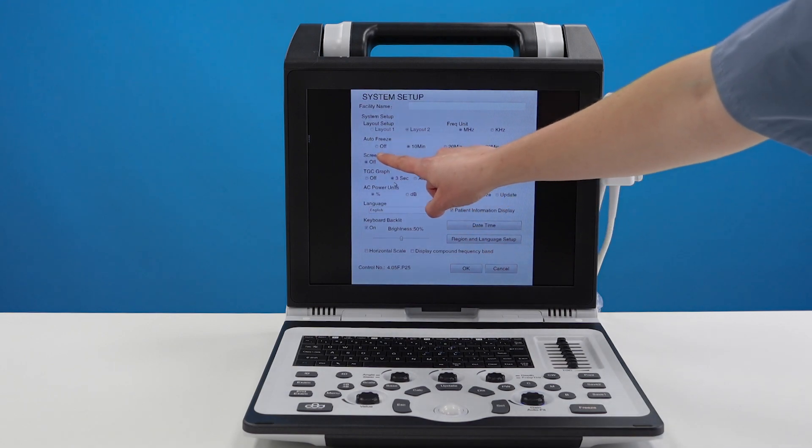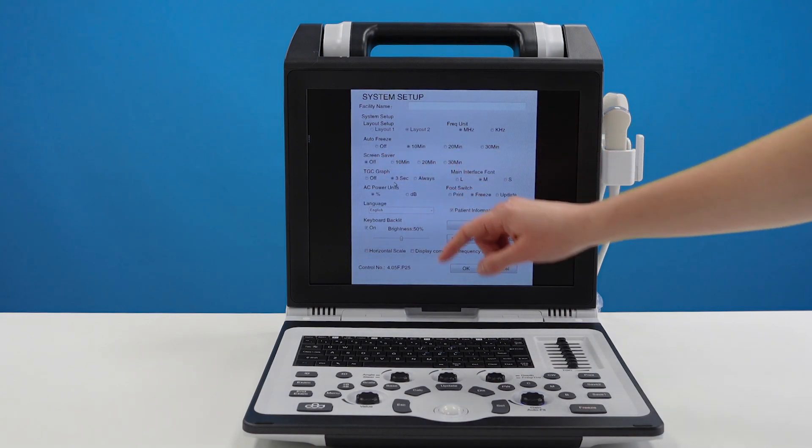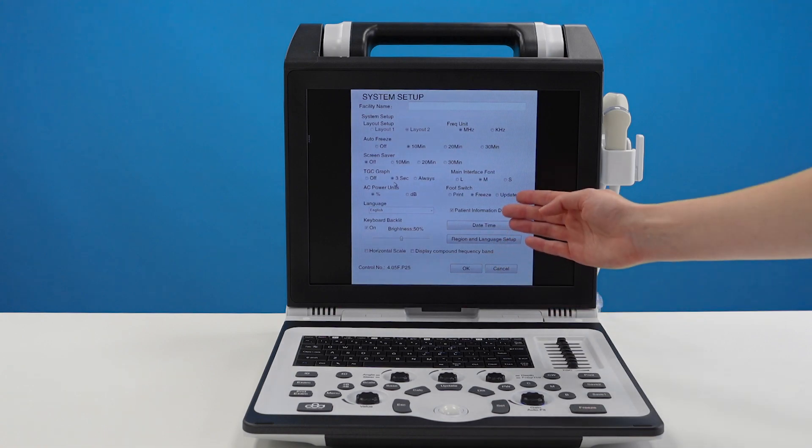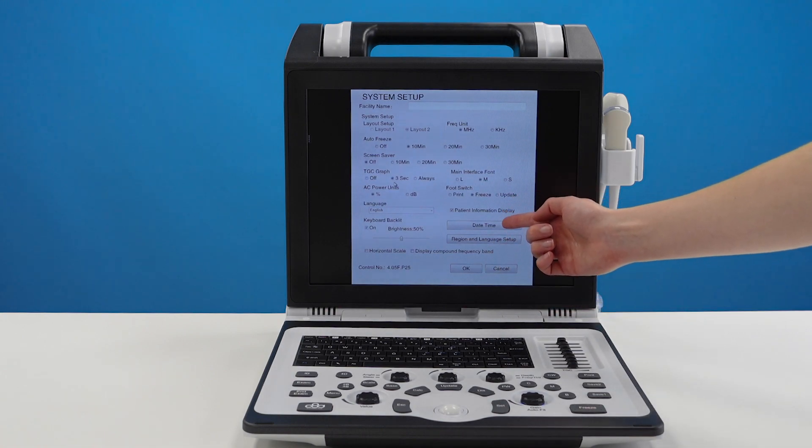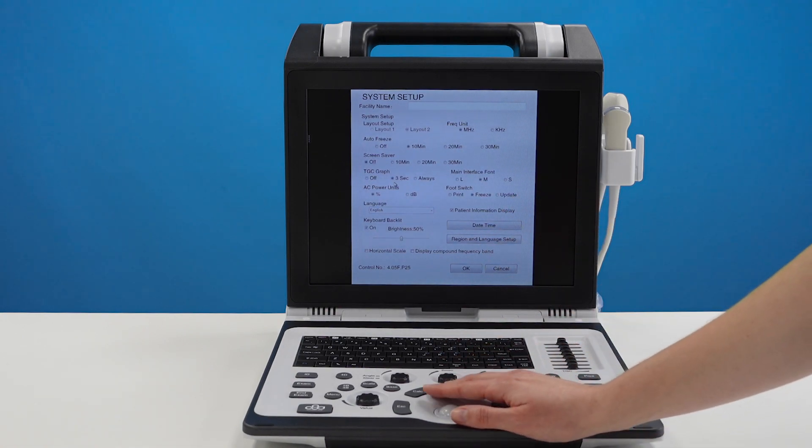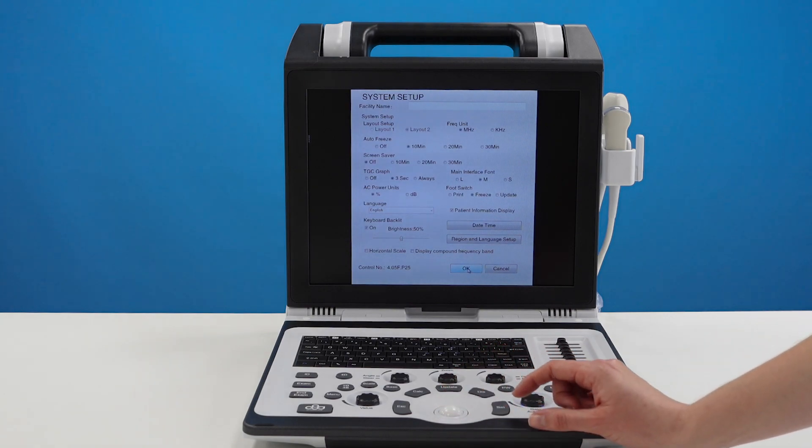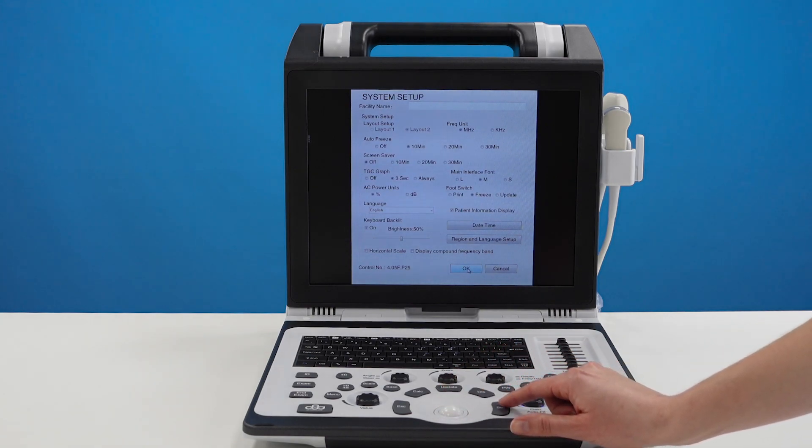You can choose whether or not you want to turn your screen saver on and you can set your date and time and your region. Once you're happy with this go over to ok and press set.